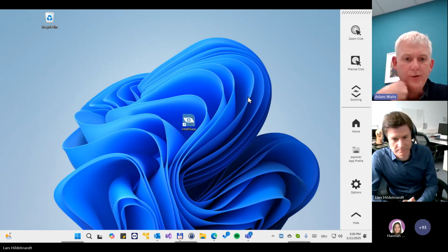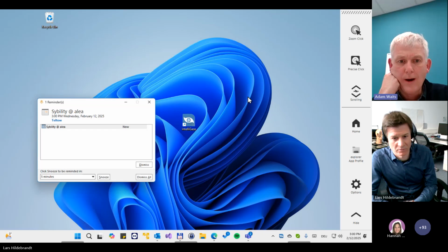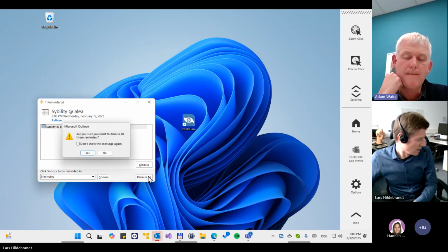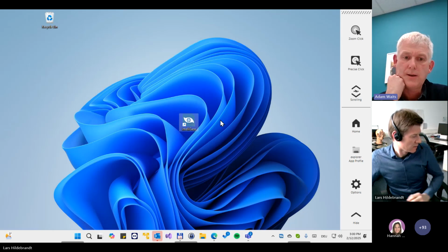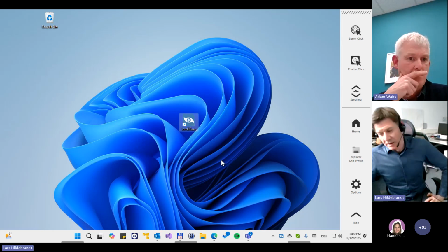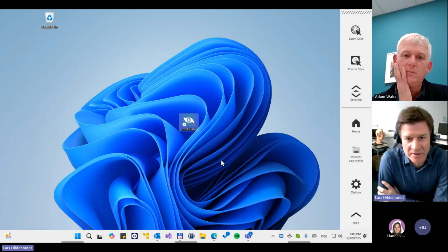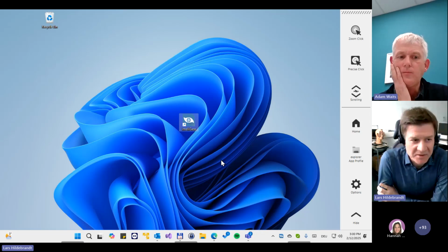So, a question from Danielle. You mentioned it's a good idea to always keep sunlight mode on because it'll know when someone is inside versus outside. What about glasses mode? If someone switches between wearing their glasses and not wearing them, should we leave glasses mode on always? Glasses mode is still under investigation. It doesn't hurt.